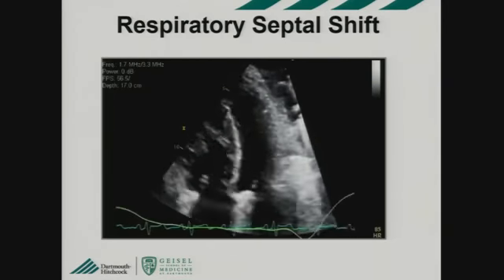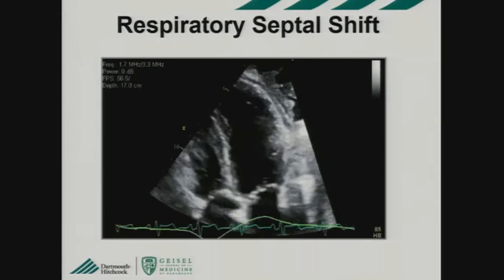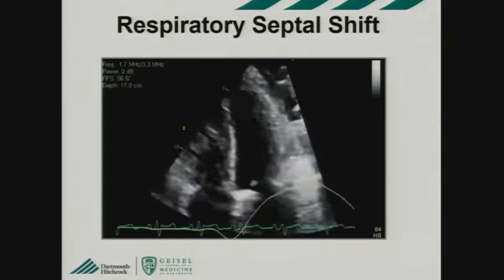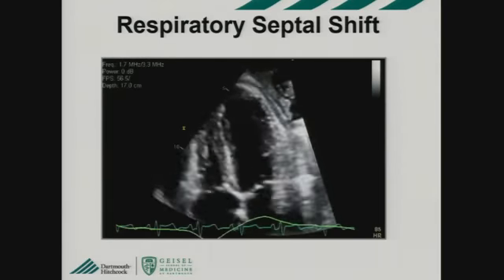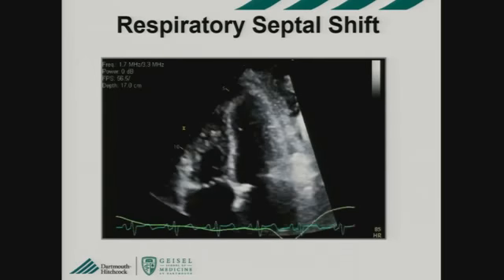This will require long clips, obviously, and an astute sonographer is key to this because a lot of these patients aren't referred for a constriction echo. They're referred for heart failure. And it's the astute sonographer who notices this behavior of the septum during live imaging and says, well, wait a minute, I need to get a 10-beat clip here, and I'm going to flag this study as, hey, I think there could be something wrong, something marking interventricular dependence. It may be subtle or it may be quite pronounced, as it is in this case.